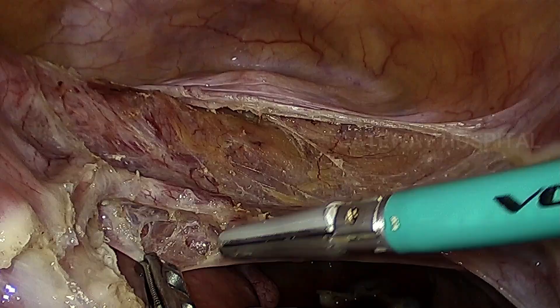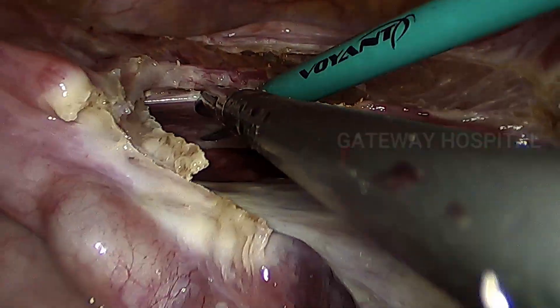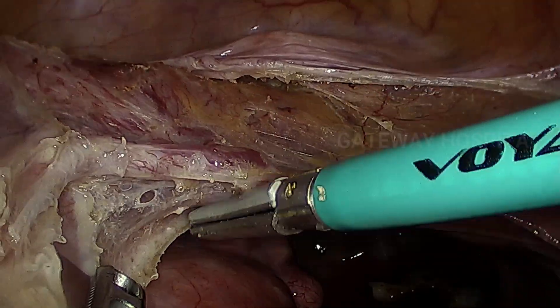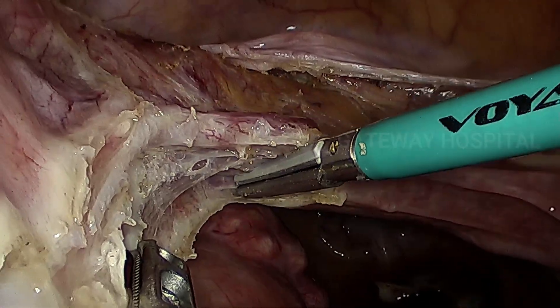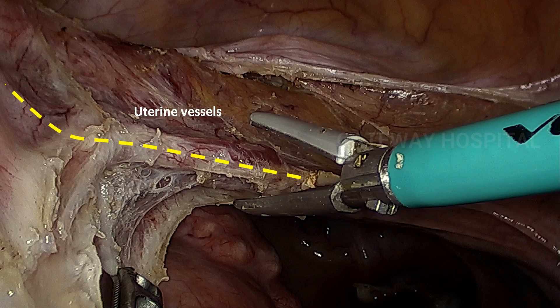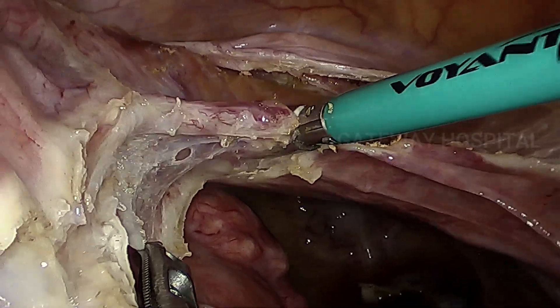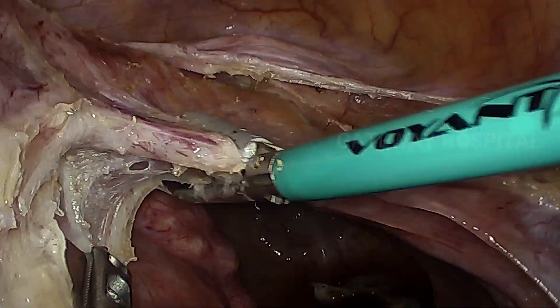The uterine vessel is skeletonized by dividing the anterior leaf and posterior leaf of the broad ligament so that the vessel can be sealed effectively and divided. You can appreciate the course of the uterine vessel. It has to be sealed at multiple places before dividing, so that the chances of postoperative bleeding will be prevented. You can see we have sealed the uterine vessels at multiple places before actually dividing.